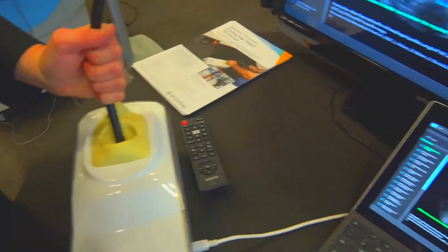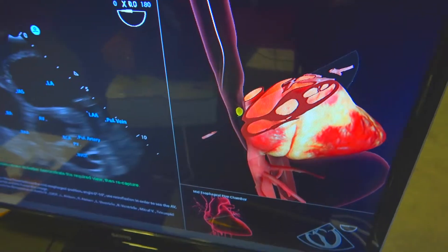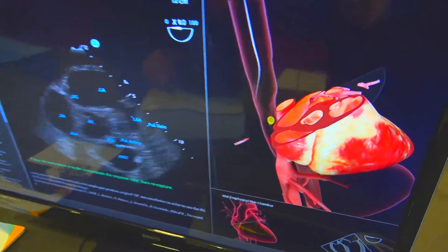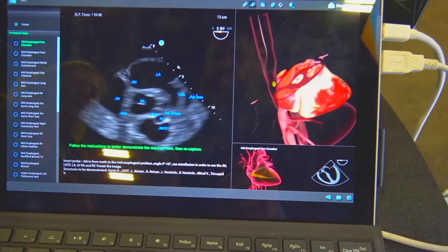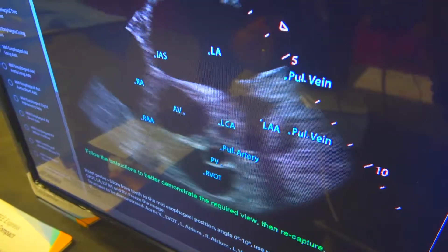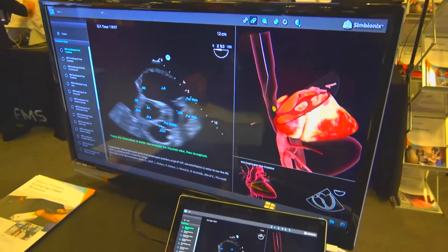We have a ghost probe and we have to line our probe up to that one. What I'm showing you here is the anatomy is actually labeled so that they know what anatomy should be inside the view they're capturing. The system will teach you how to capture all 28 views and then on task 2 you can go back and label them. We also have a normal patient and in addition to that we have a lot of pathologies.